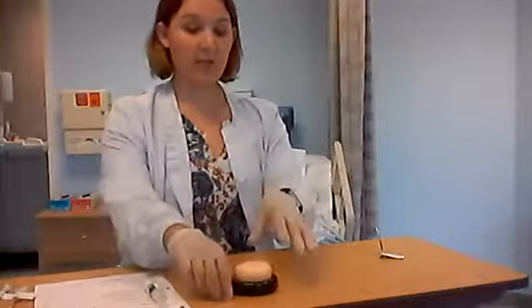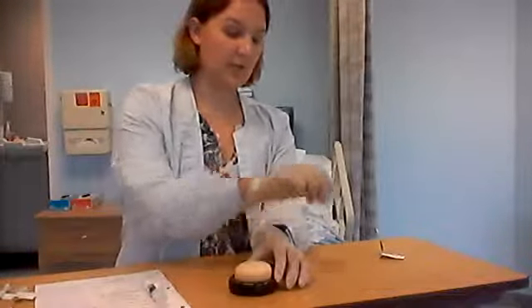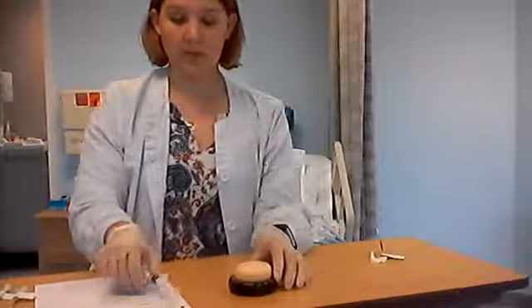We're going to go in the vastus lateralis. I'm going to assess my site. Any redness, bumps, bruises, irritation, scar tissue, we're not using it. Site looks good. Again, we're going to clean, that circular motion, inside to out. You would have a new prep pad for each site. Okay. With the IM injection, we're going to a 90-degree angle. We're going to use the Z-track method.